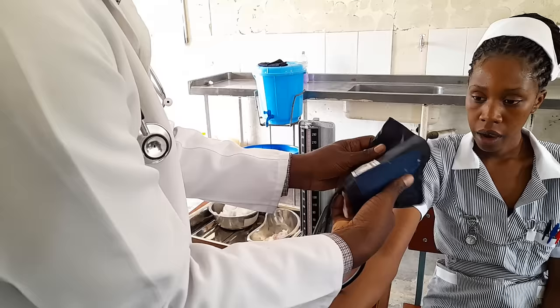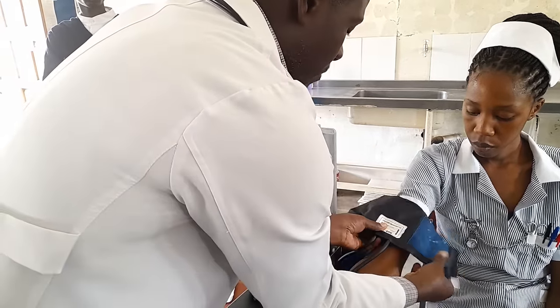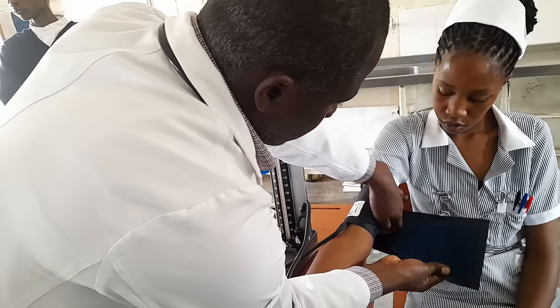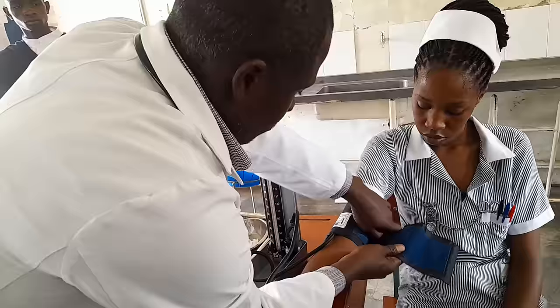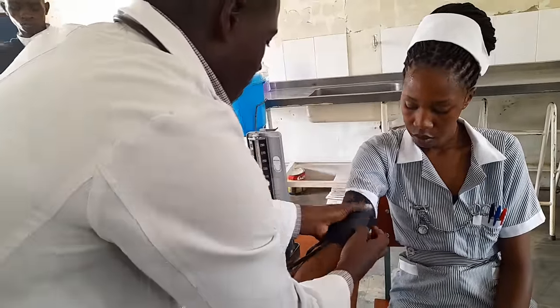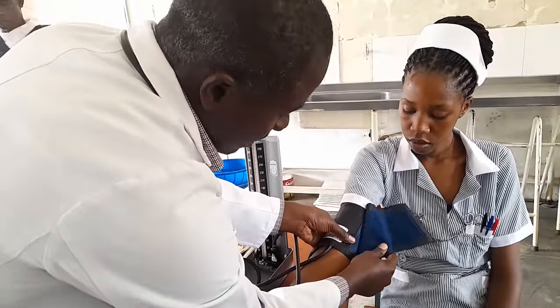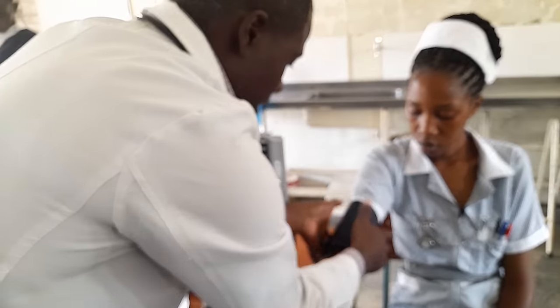To put it correctly, place it like this. We're using the right arm. Ensure that this part adheres to the other part. In case the client's arm is small, only a small portion will be attached, and that's fine. Put it like that.